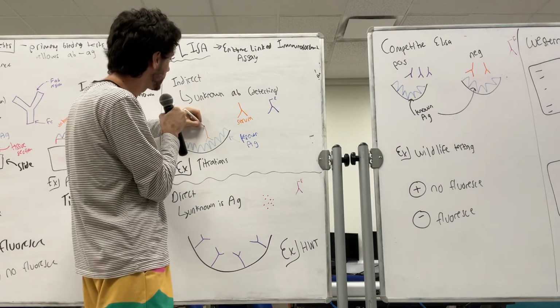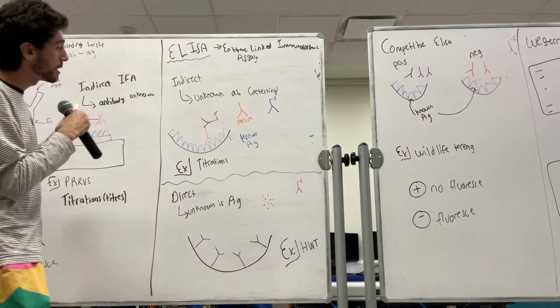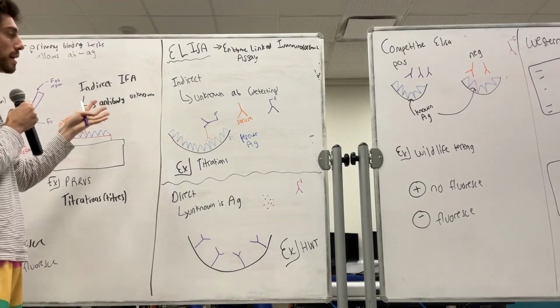All right, and then it's going to bind like this, and so then we're going to see a fluorochrome, we're going to see a color emitted, and we're going to know that it's positive.